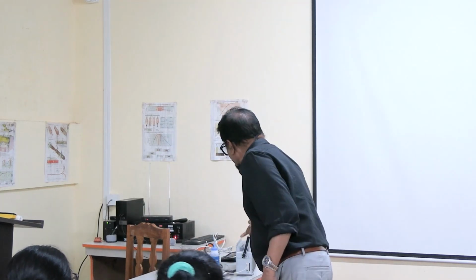Don't confuse it with graph paper. Electrocardiogram is the record this machine produces. So this is the difference between electrocardiograph and electrocardiogram.